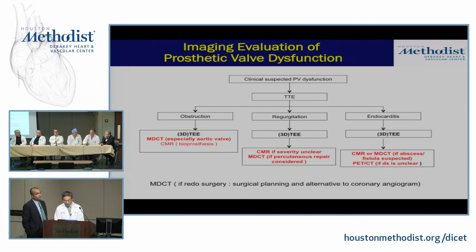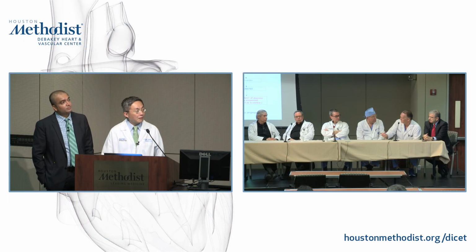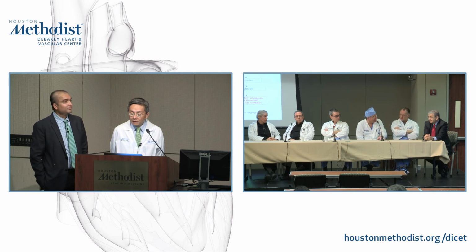Yeah, I think, Dr. Lawrie, you're asking about the 4D CT, and that's part of all the clinical trials now, because there's a rate of thrombus formation on these leaflets that's sort of undefined prospectively. The reason I asked is we've had a couple of cases and all five of us weren't sure what was in there or not. It's a difficult area.